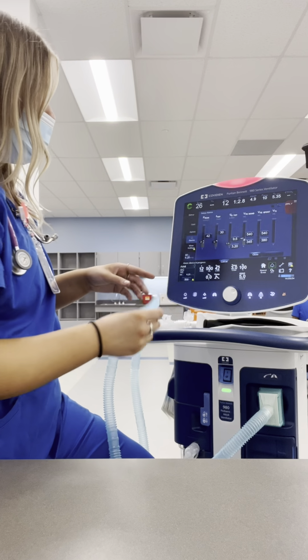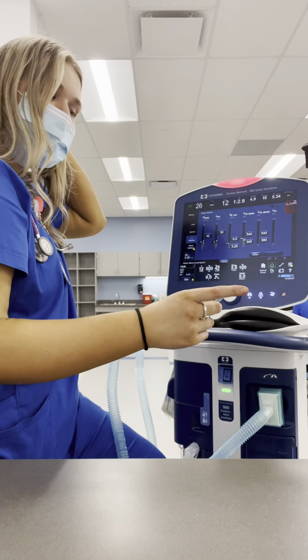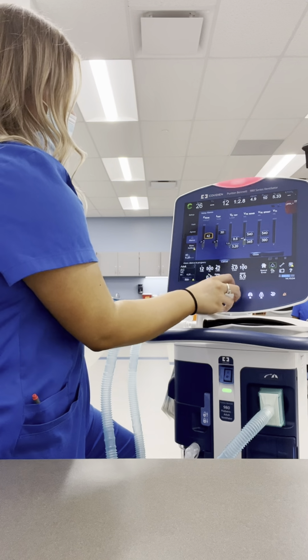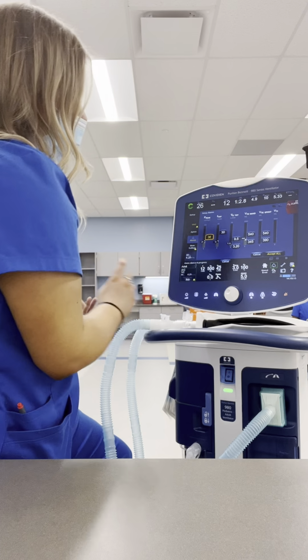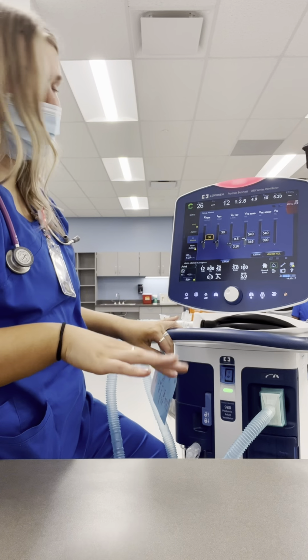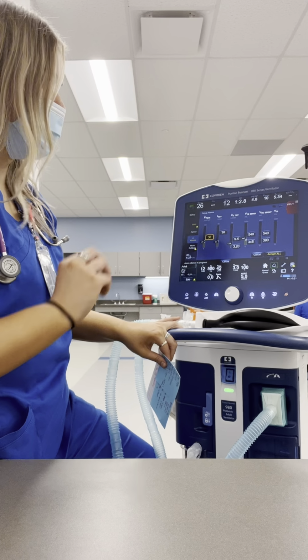So in my alarm panel, the first thing I'm going to do is set all my normal alarms. For the peak, I'm going to do that as 10 above, so it's at 26. We're going to make this 36. And then for the frequency, I put that at 30. And for the minute ventilation, we did 4 above and 2 below, so it's currently at 5.3. We put the high alarm at 9.5 and the low alarm at 3.2.